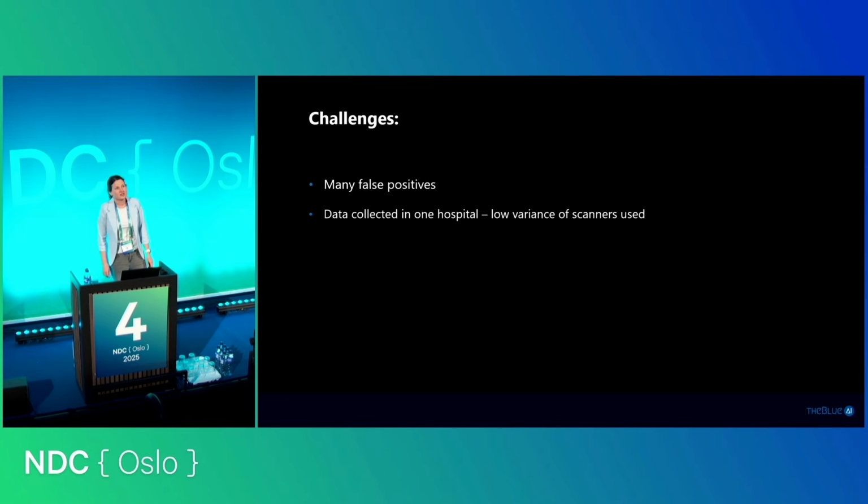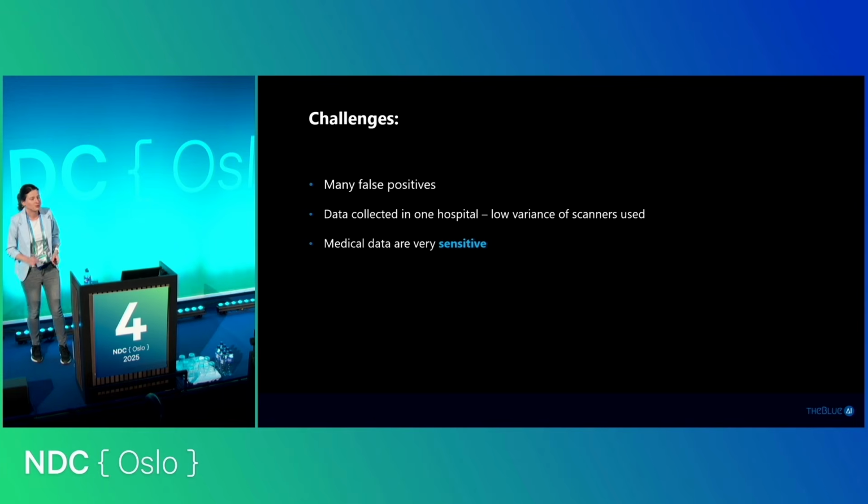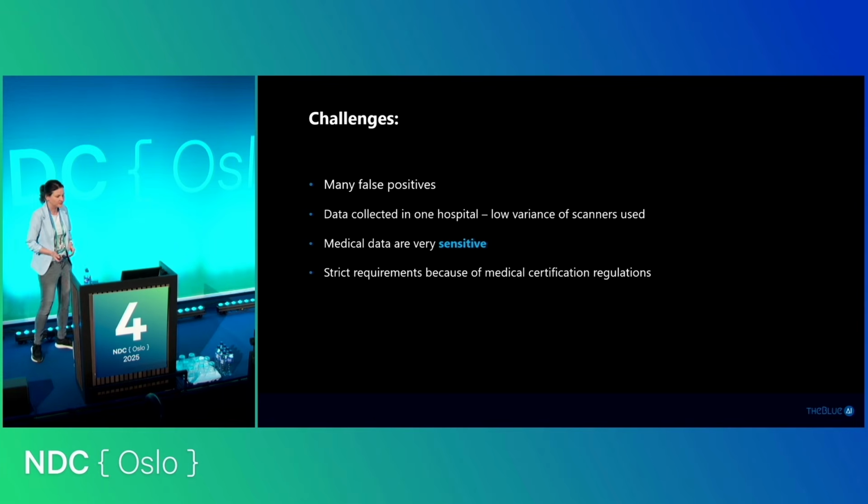Secondly, we have data that were collected only in one hospital, so we have quite low variance of the scanners used. It can be quite obvious, but we are working with medical data, which are very sensitive, and this will be important for the next part. And it's also connected with the fact that, if you ever try to implement any medical projects using AI, you will know that the medical certification regulations are really a nightmare. There are very, very strict requirements connected with them.